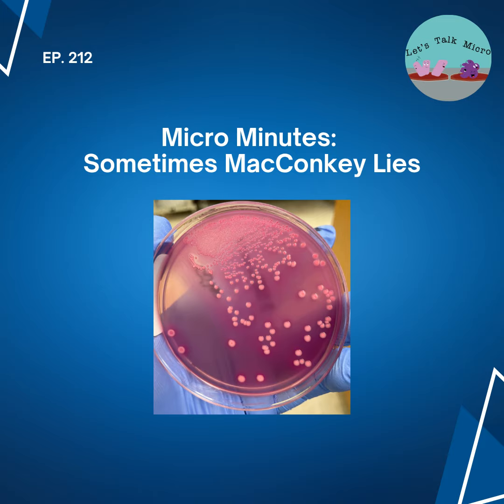So let me give you a scenario. For those of you that work in the lab in clinical microbiology, let's say you get a wound culture. You plate it on blood, chocolate, and MacConkey, as we normally do. The next day, nothing is growing on Mac. You have growth on blood agar and on chocolate, but no growth on MacConkey. And then you think, okay, it is not growing on MacConkey, so this is not a gram-negative rod. Maybe you have moldy stuff in your lab, maybe that day is down, and you don't want to do a gram stain, so you're like, okay, I'm safe. Not growing on MacConkey, I don't have a gram-negative rod.